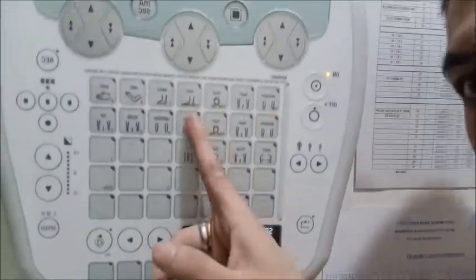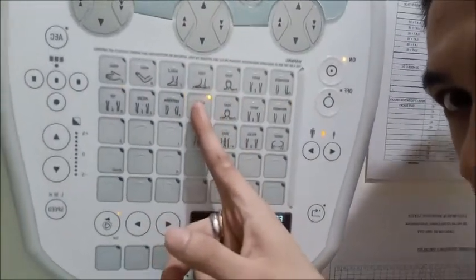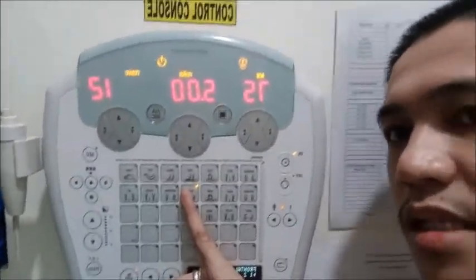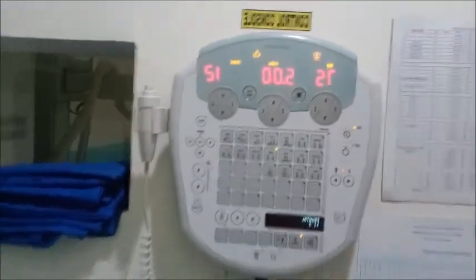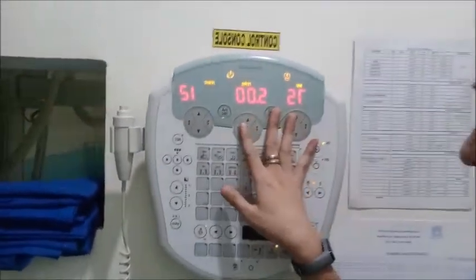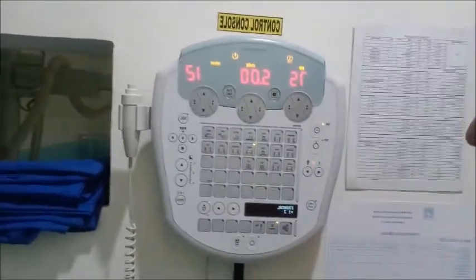And then what type of examination, and then the set of factors. Okay, so it can still be adjusted depending on your examination, depending on the body habitus of the patient. So both can be adjusted. The mAs and also the kVp setting can be adjusted.